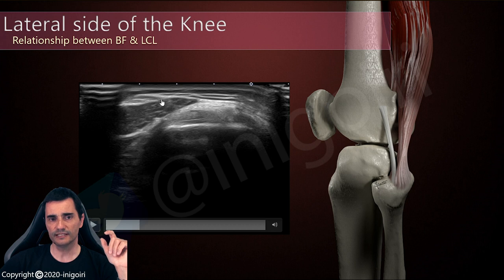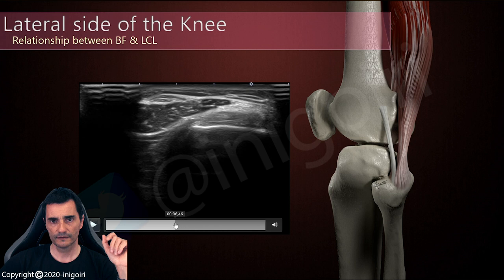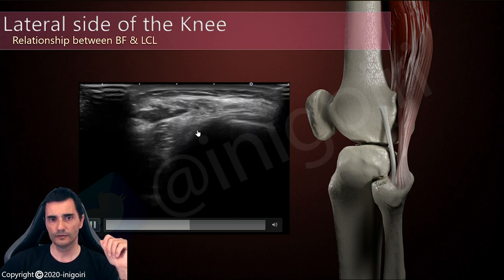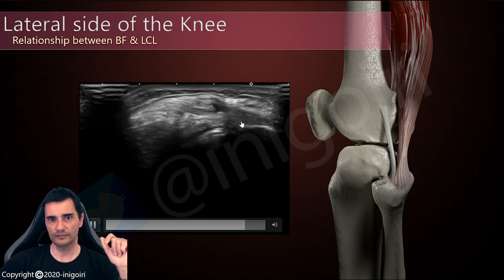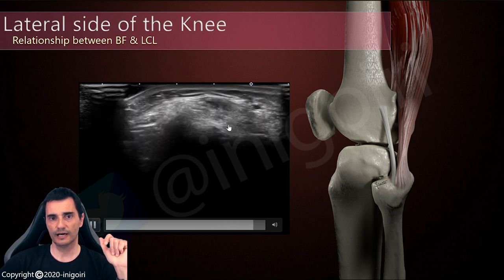If we follow these two components distally, we notice how they surround the lateral collateral ligament. As we go distal, this is the lateral collateral ligament on its short axis. Notice what happens as we go distal — the biceps femoris surrounds the lateral collateral ligament, and they both insert in the fibula. They surround the lateral collateral ligament and the insertion at the head of the fibula.